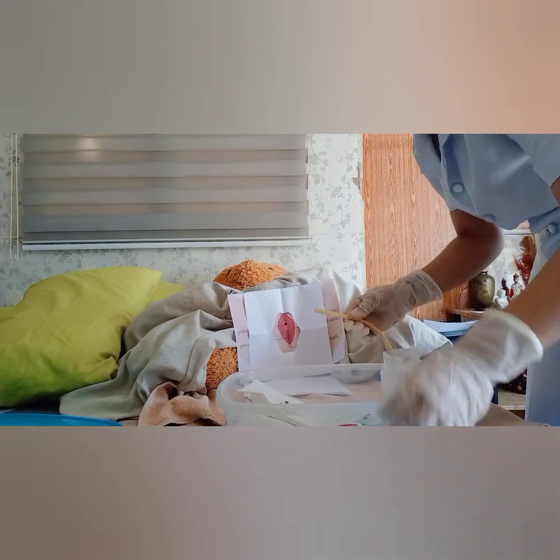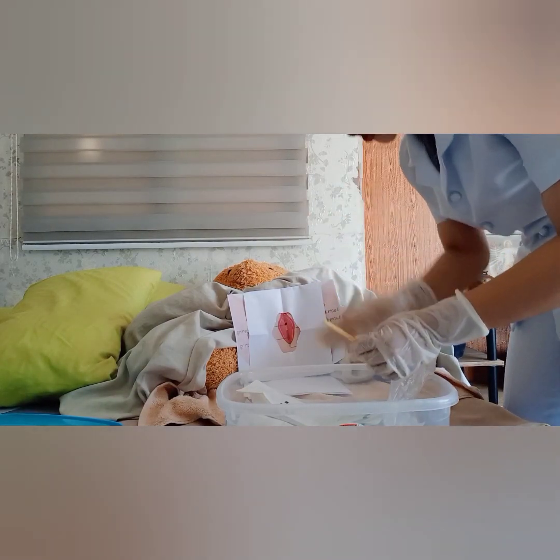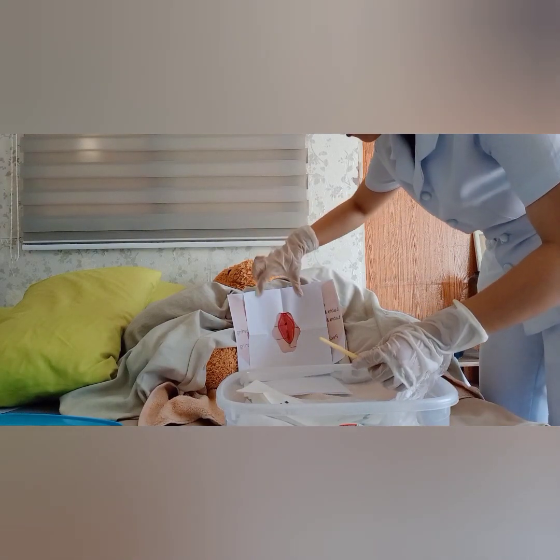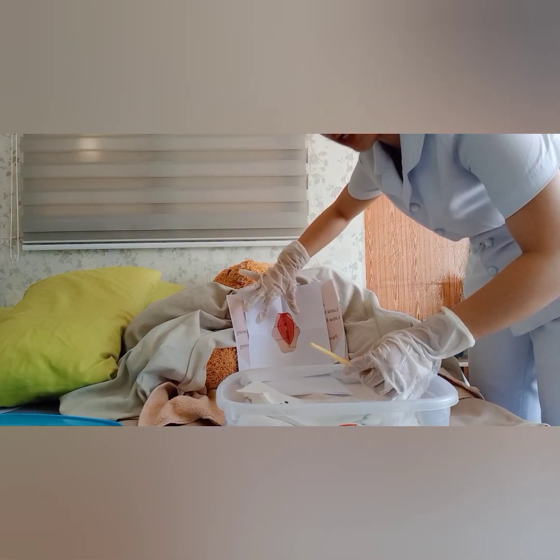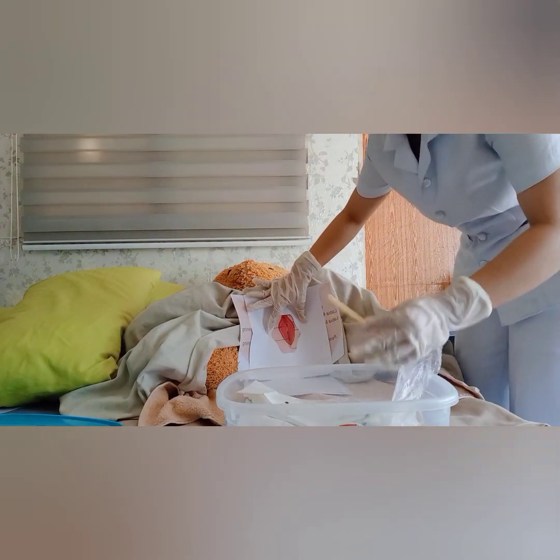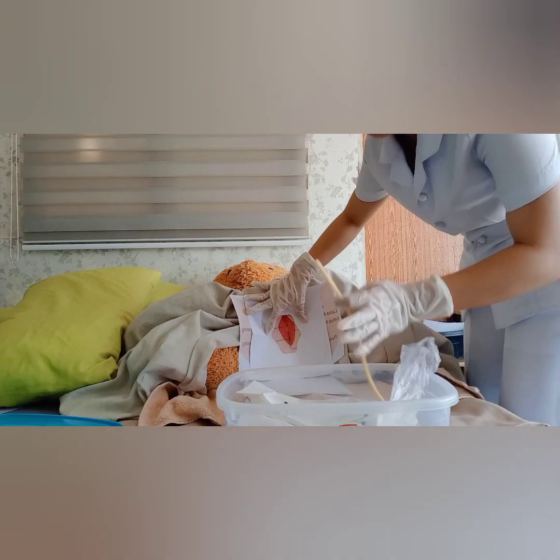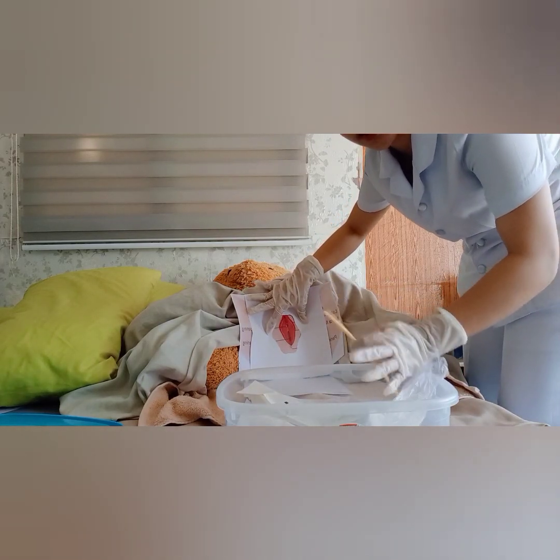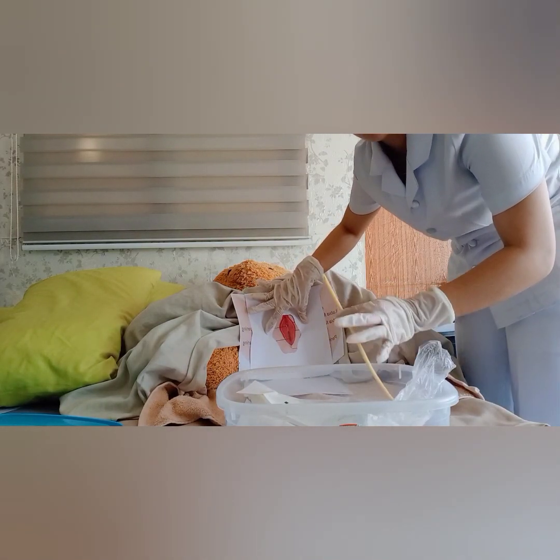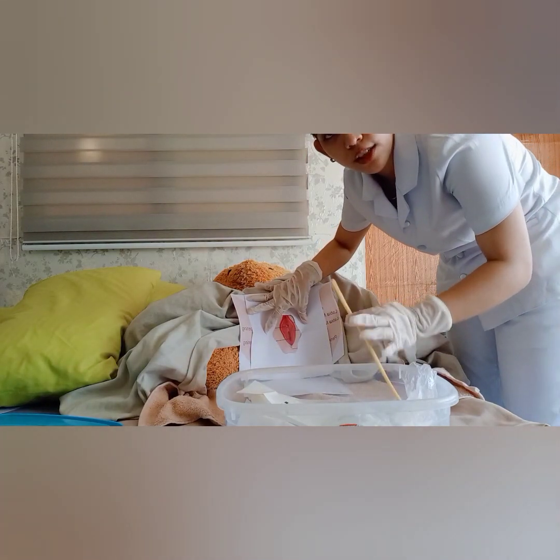So now we are gonna pick up the catheter at least 3 inches from the tip with the thumb. So place the thumb and finger of the left hand between the labia minora. Okay? And the rationale for that is to straighten the urethra and facilitate the insertion. So the next thing that we're gonna do is insert the catheter into the meatus for 2 to 3 inches or until the urine begins to flow.